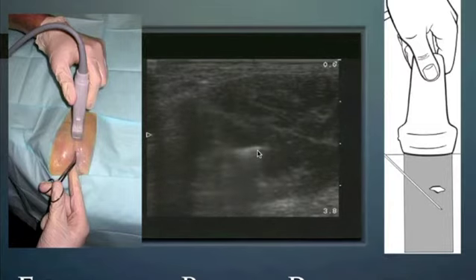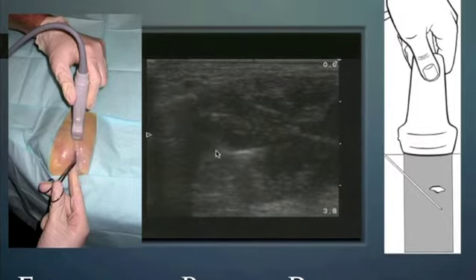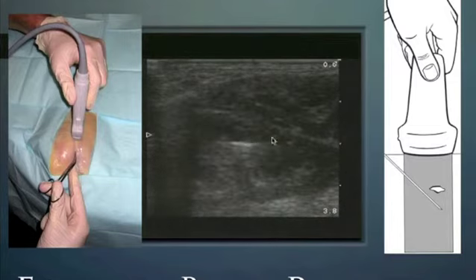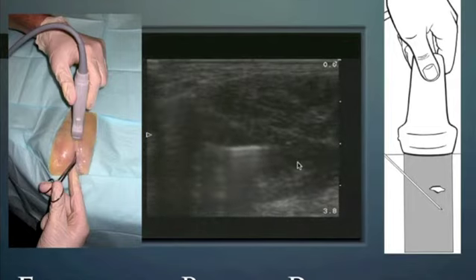centimeters. These are 1 centimeter hash marks. So we get down to about 2 centimeters below the skin line, and we guided a needle down to the foreign object, placed a guide wire through the needle, and then we removed the needle, and then we did blunt dissection down the edge of the guide wire with our grasper until we were able to come in contact with it, in which case we extracted the foreign body.